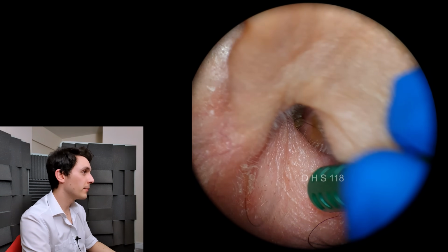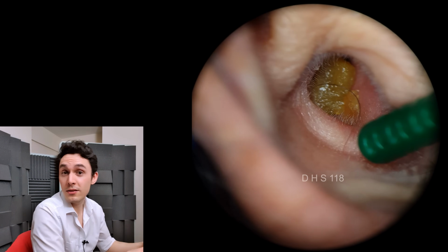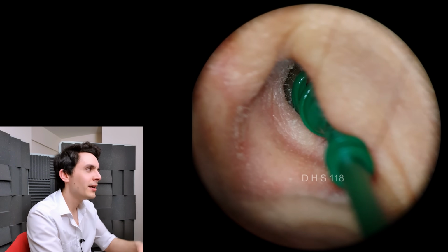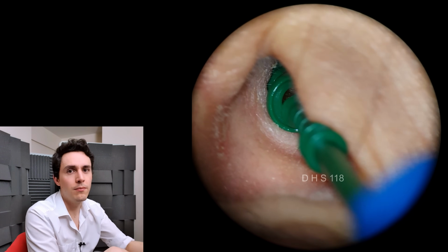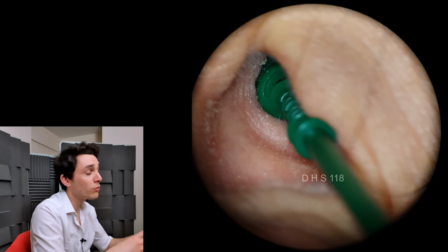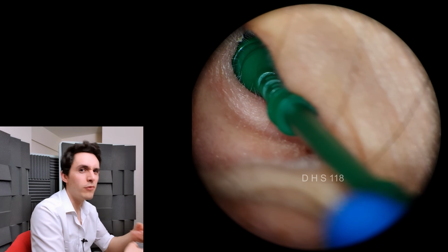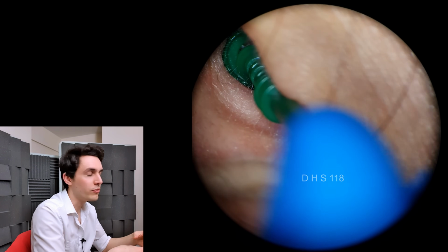Generally these devices are good for most cases where you have wax in the first two thirds of the ear canal. It's a little bit more difficult to use when the wax is much deeper near the eardrum, and it's also not great for very soft mushy wax or very runny wax, or again, if you have wax on the drum or in the recesses, then it's not very appropriate.